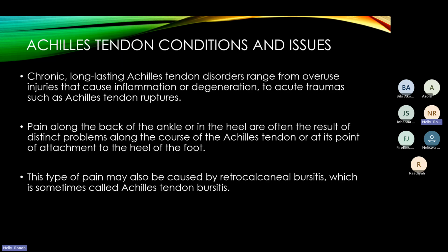So, the Achilles tendon conditions and issues. Having seen how the normal tendon looks, in chronic or long-lasting Achilles tendon disorders, they range from overuse injuries that cause inflammation or degeneration, to acute traumas such as Achilles tendon rupture, which could either be complete or incomplete.